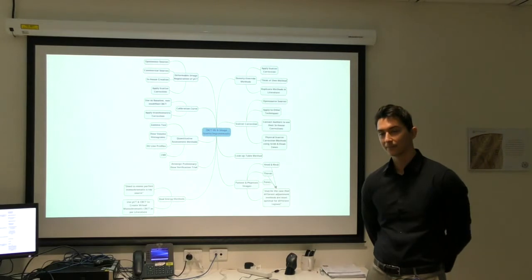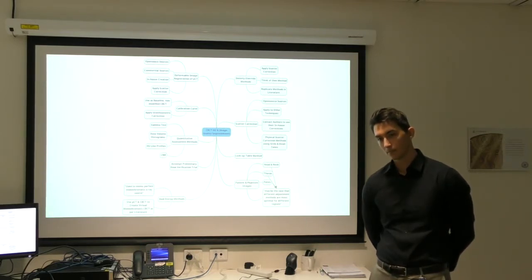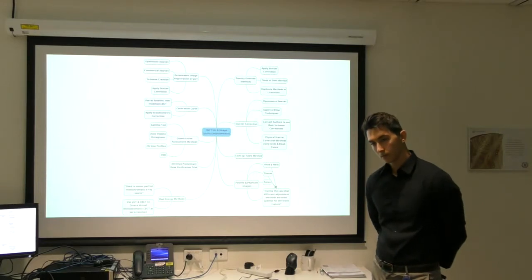So you're eventually thinking about the accuracy of those calculations. But then considering that the image quality is different on a CT compared to a CBCT, and the accuracy is not lining up to the doctor. So then your structures will be... Are you using the same structure set of the CBCT?